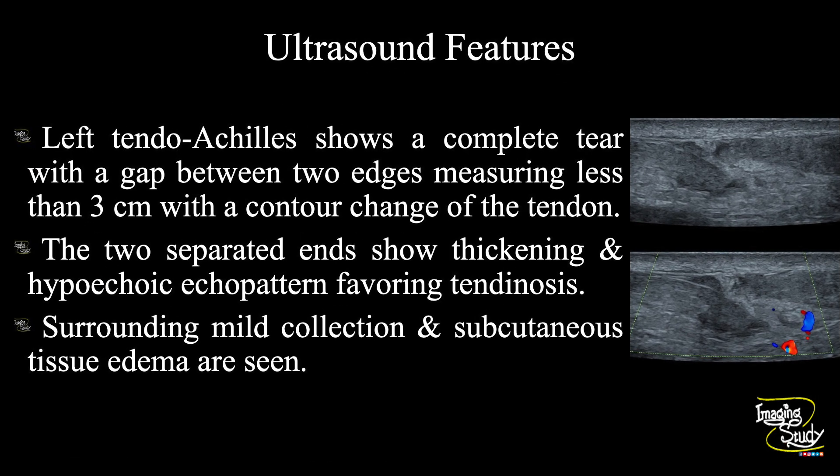In summary, the left tendo Achilles of this patient shows a complete tear with a gap between the two edges measuring less than 3 centimeters, with a contour change of the tendon. The two separated ends show thickening and hypoechoic echo pattern favoring tendinosis. Surrounding mild collection and subcutaneous tissue edema are also present. These features conclude it as a case of full thickness tendo Achilles tear with surrounding mild collection and tendinosis.